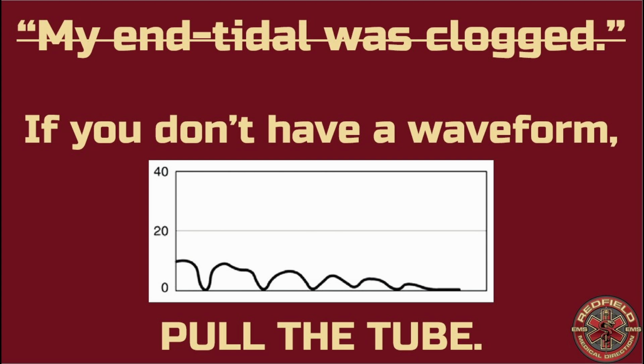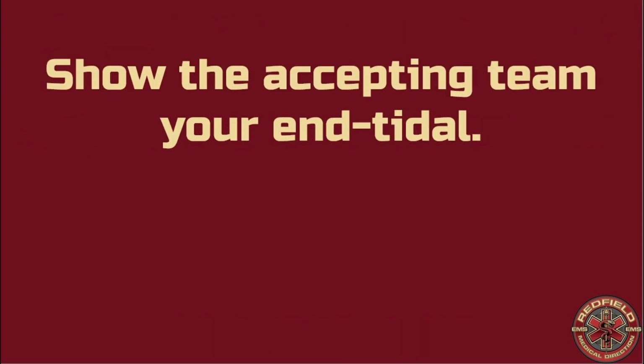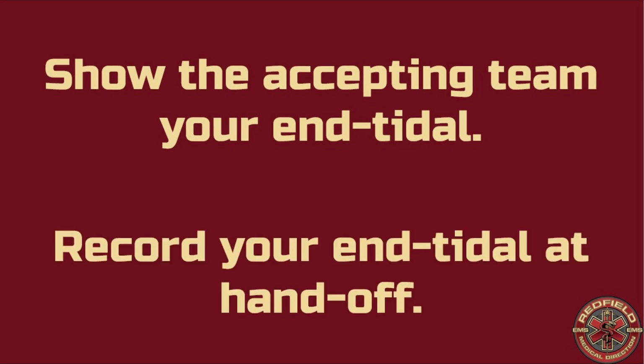Some good advice on this, guys, and I stress it with all my crews as well: you need to confirm the tube, but when you hand that patient off, make a special effort of showing the doctor or the nurse you sign out to, "Hey, I got waveform." And whatever monitor you have, make sure you hit an event or whatever marks it, so you get a good waveform at time of handoff. As we all know, stuff rolls downhill. They're going to blame you guys if a tube gets displaced. And if you can't prove that you had end-tidal when you handed it off, guess what? You're in trouble.